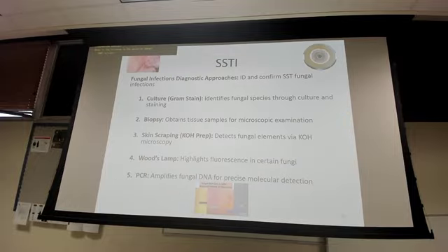All right, fungal infections, diagnostic approaches, identify and confirm SSTI fungal infections. Again, gram staining. You could provide some biopsies if needed. You do skin scrapings or KOH prep, which you can possibly do at the bedside. And then you can also identify fungal elements with a Wood's lamp. And we'll talk a little bit about that in the next couple of slides.